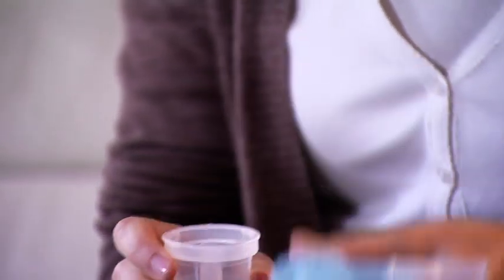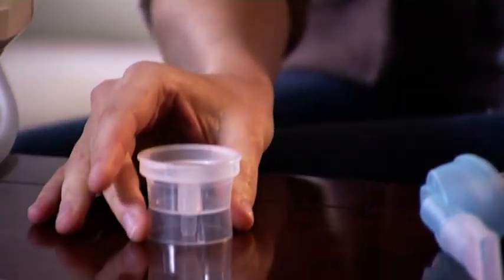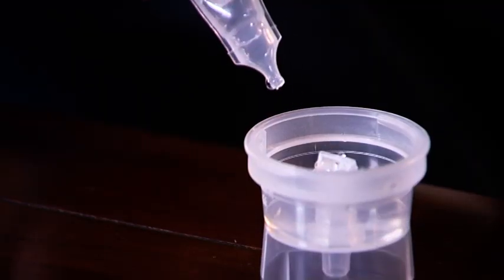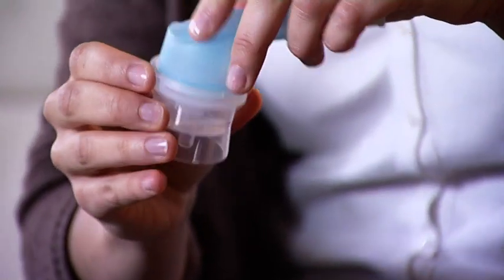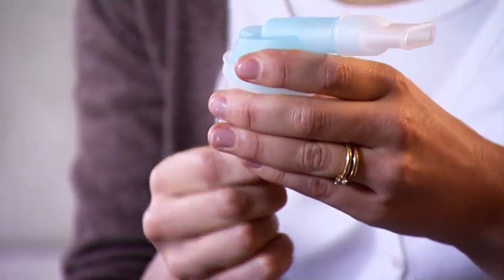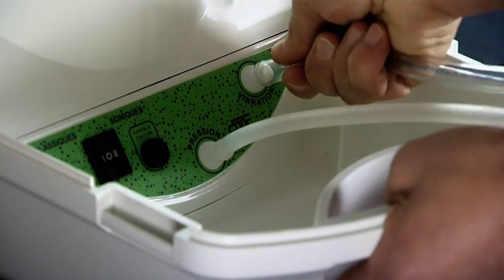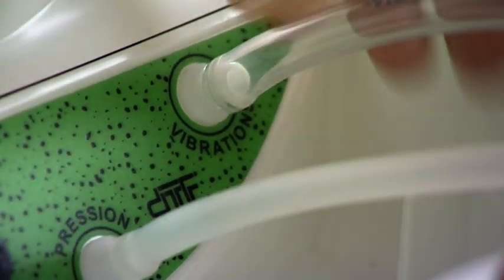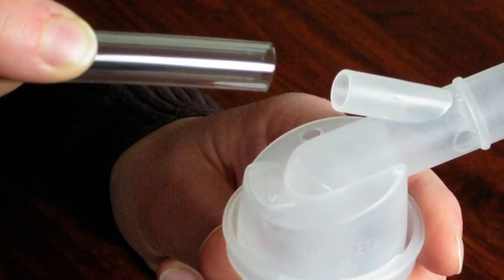Unscrew the upper part of the nebulizer and pour all the medicine in the tank. Screw the upper part of the nebulizer back on. Then, connect the other end of the tube to the inlet of the nebulizer. For a sonic model, connect the second and largest tube that reads vibrations to the corresponding outlet of the compressor and then to the upper part of the nebulizer.